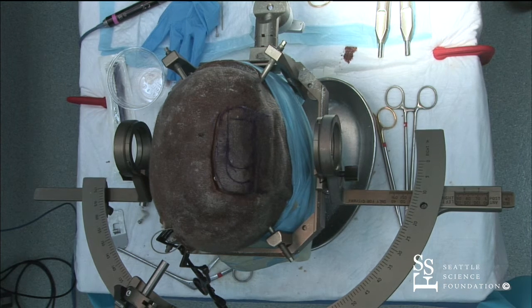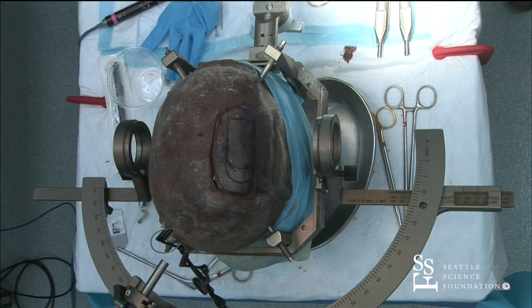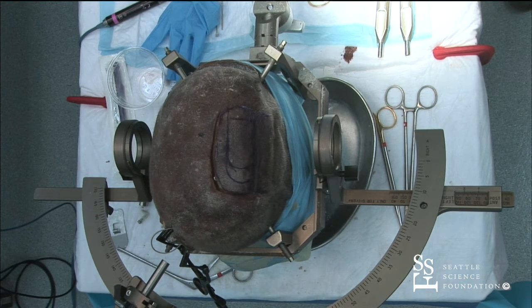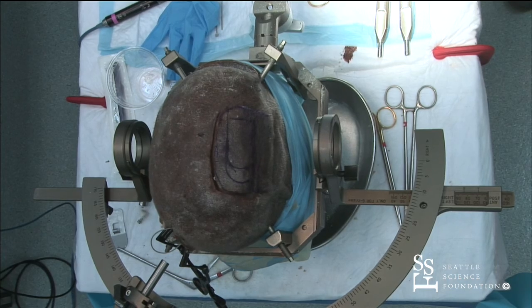And the recordings that we get are beautiful. They're gorgeous recordings. Whether or not in the end we could have gotten away with one that was further away, I don't know. But it's actually a very cosmetic result after the hair grows in again. It's a little more difficult because you're stretching the skin over this fixed object. But as long as you are really careful about how you close it, it actually is a very good cosmetic result, and there's no battery below.